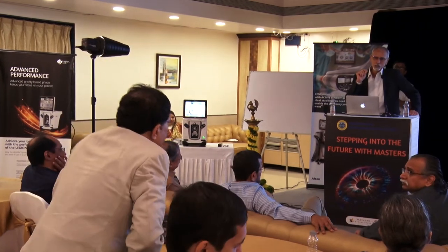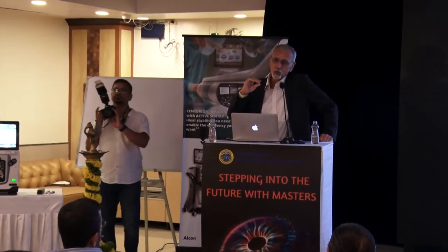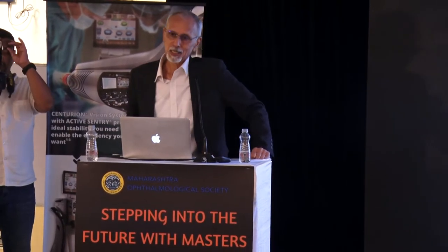When you do such maneuvers, you want your capsule to stay very steady. So you fill it with viscoelastic and you kind of stretch the pupil. When you use irrigation, your capsule is all the time going up and down, and that's when those fine movements cannot be done. Now here, with the sharp cystotome, when you try to go, not touching the posterior capsule, but to be in the plane where the plaque is, you have to have everything steady, and that works better with a nice viscoelastic fill.